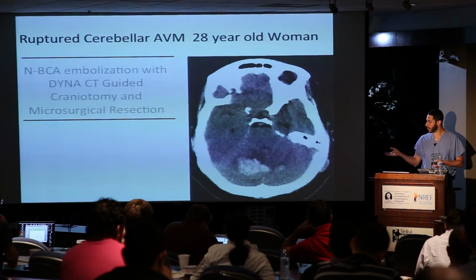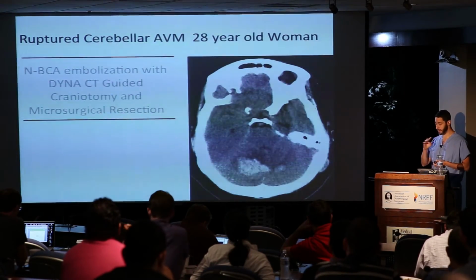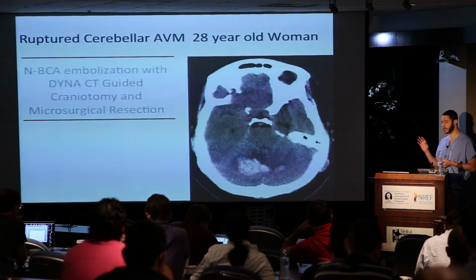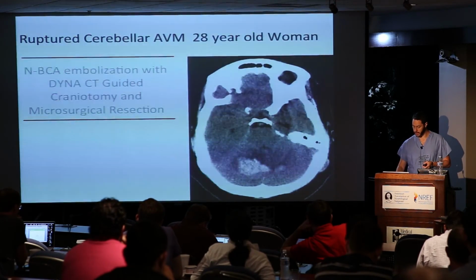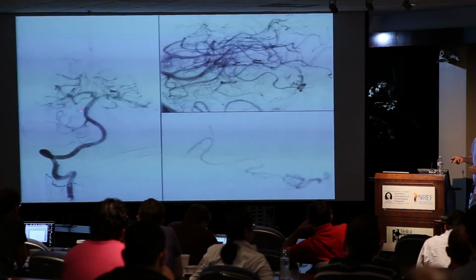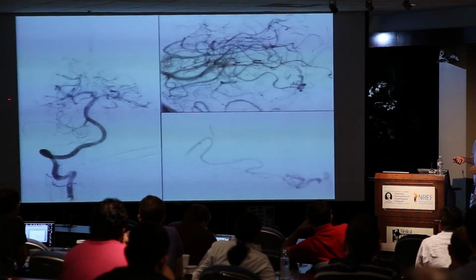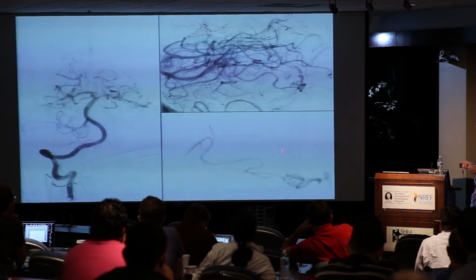This is a little bit different. This is another ruptured AVM, and this patient, again, does well clinically, sent home to recover, comes back about a month to 6 weeks later, and angiography, a little busy over here, oblique picture, clear abnormality, but I would never really understand this AVM until I get to a picture like this with a microcatheter. This is a marathon.